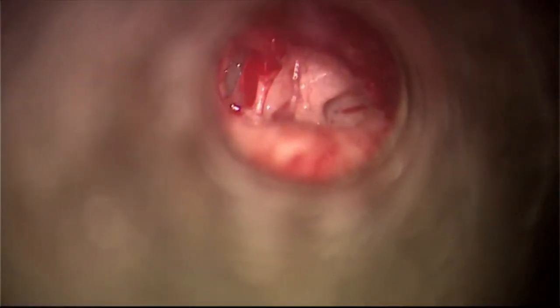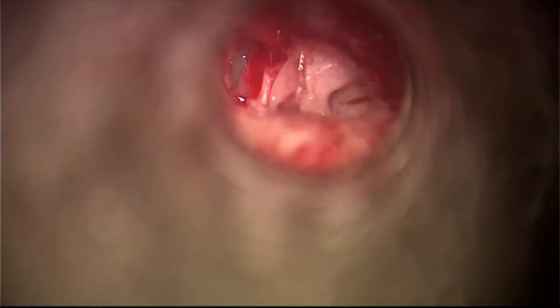Let me try that on the sheep head. Center, please, center. Yeah. I am trying to find my laser beam. The posterior. Can you see my laser beam now? Yes.